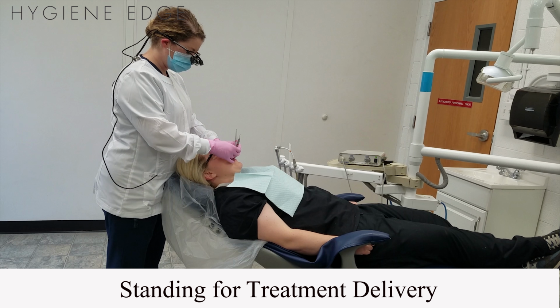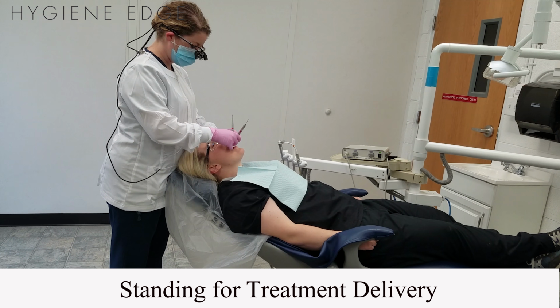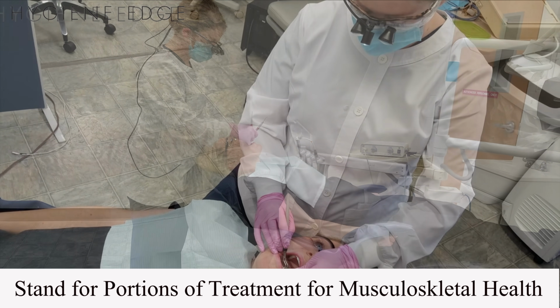Standing while delivering treatment is occasionally needed during treatment of patients who are compromised and may not be able to lay back in a chair. It is also beneficial to mix up your routine and stand for portions of your treatment delivery.